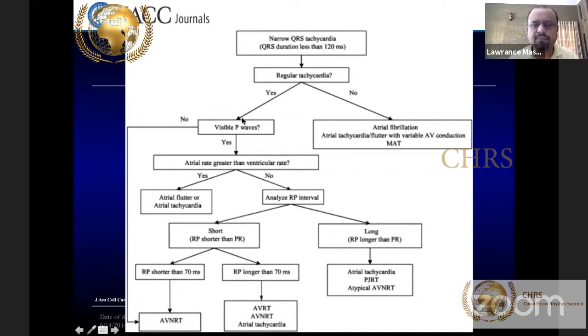Next, I already told you about your QRS and ST area; you clearly look at whether you are able to see a P wave. If you are not able to see a P wave, you look very carefully in the tachycardia ECG, and still you are not able to see a P wave. The most common narrow QRS tachycardia where you cannot see a P wave is AV nodal reentrant tachycardia. This is important because if you understand the mechanism, the tachycardia comes from the AV nodal area, in the junctional area.